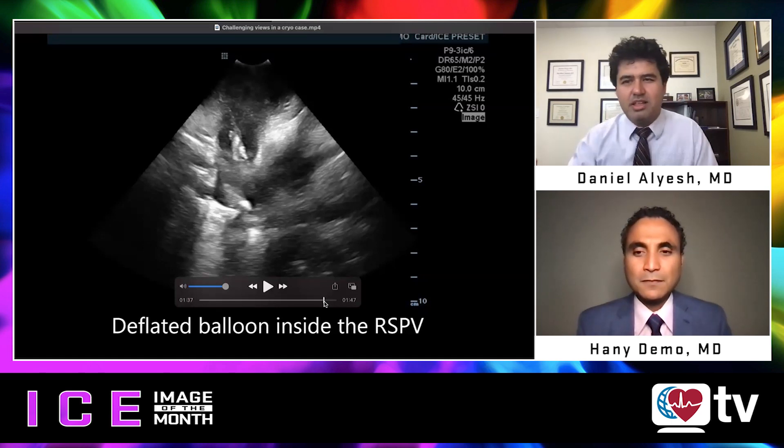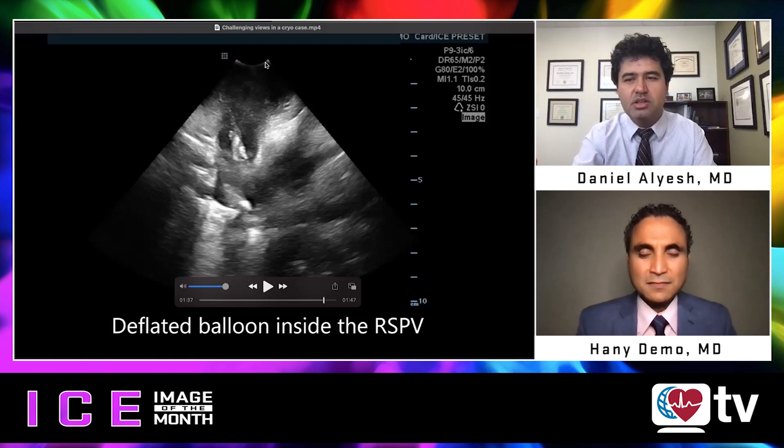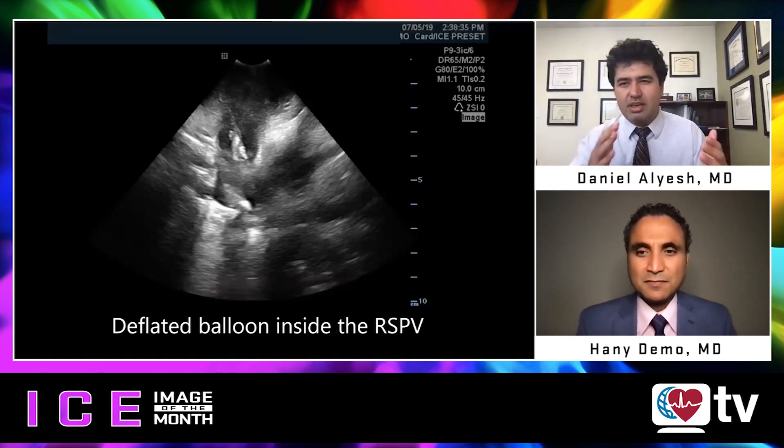It's important to understand that what's in front of the probe is anterior, and you have a proximal and distal marker. Really thinking about ICE and manipulating the catheter in that way will help you significantly.